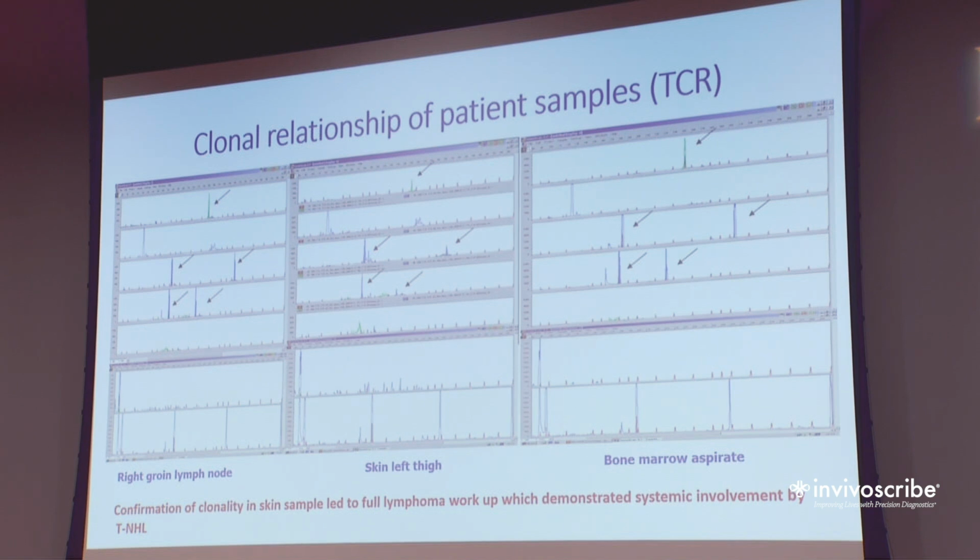So they sent us down the skin biopsy, and you can see here, this is the first biopsy we received. On the T cells, you can see we brought up the TCR beta mature rearrangement plus the two immature D2Js. And then we brought up the gammas as well. Once those findings went back, this man was brought in for a full clinical workup.